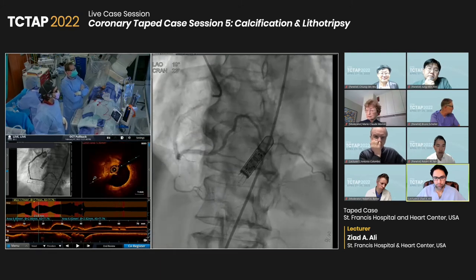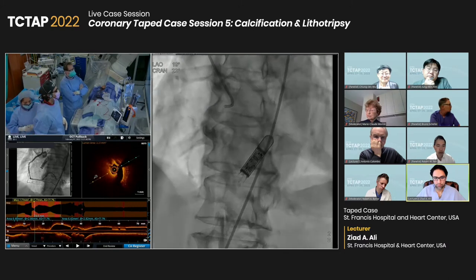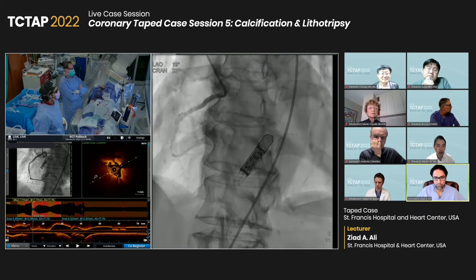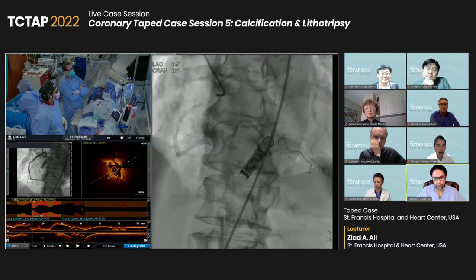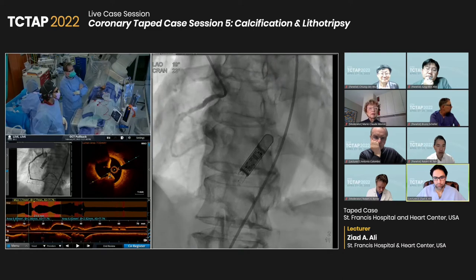Show the nodule a little bit further distal where it's still visible. And so the problem is with the eruptive component of the nodule, we haven't really shaved a lot off. You can see by ballooning, we've got a deep dissection. But we did do a number of low speed runs and really focused in there. But I think what's happening is jumping forwards and backwards.